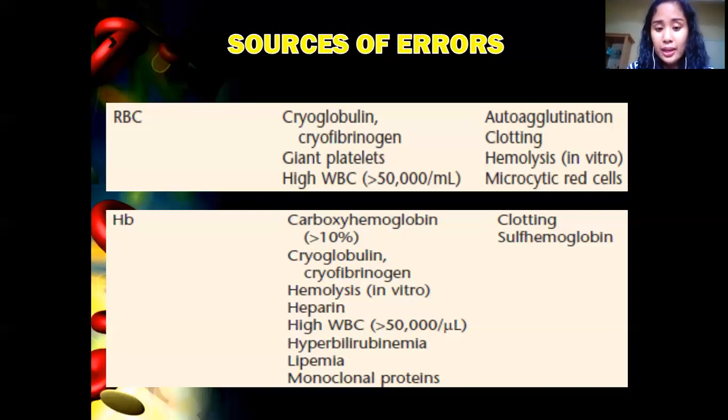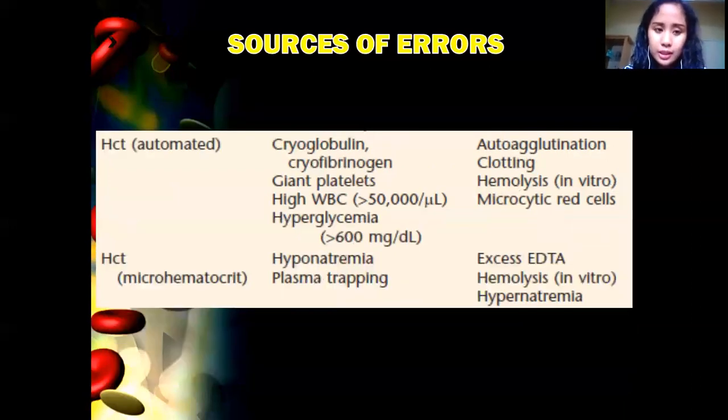So, in cases of lipemia, hyperbilirubinemia, so may excess na pigment. So, it can erroneously increase your hemoglobin. Clotting can decrease your hemoglobin. Hematocrit, automated, computed naman siya eh.